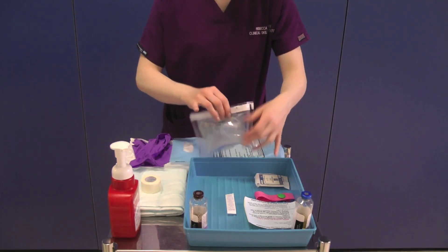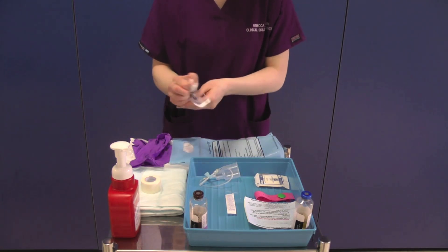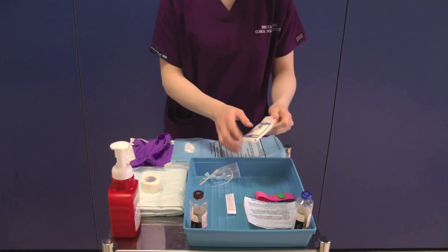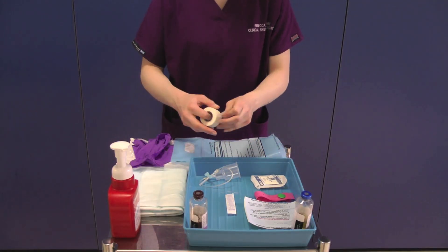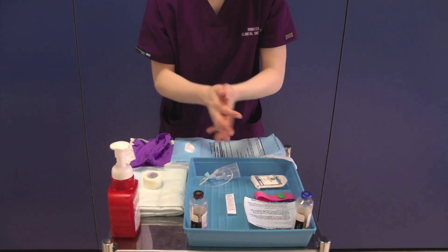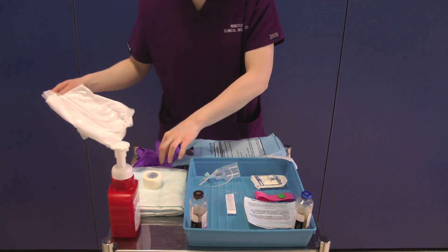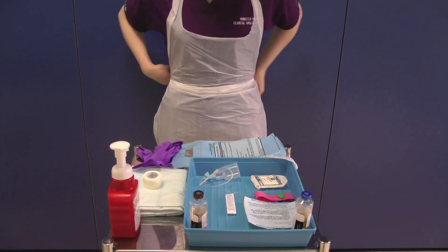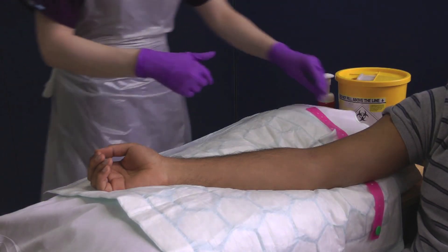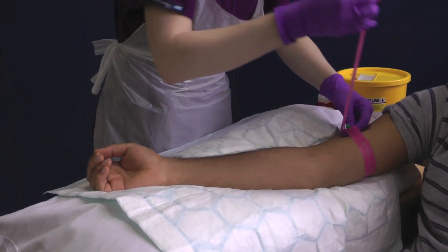Open the collection set, ensuring the key parts are still protected. Partially open the sterile gauze and remove a strip of tape in preparation for use later. Decontaminate your hands and apply an apron and non-sterile gloves. Reapply your tourniquet to distend the vein. Do not repalpate the cleaned area of skin.